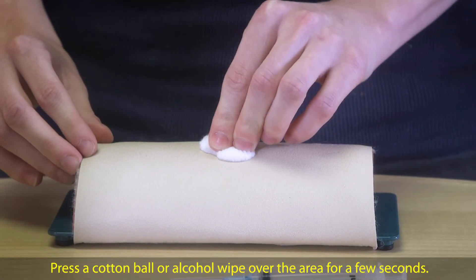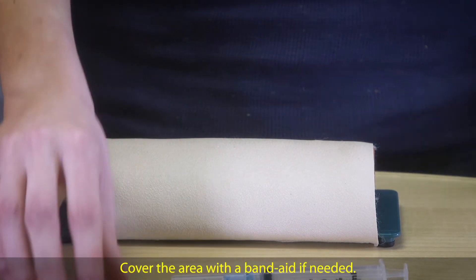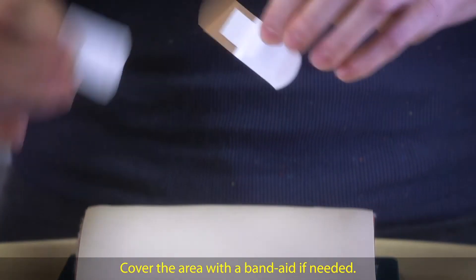Press a cotton ball or alcohol wipe over the area for a few seconds. Cover the area with a band-aid if needed.